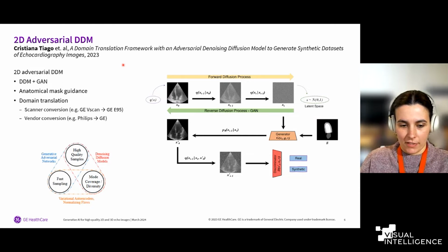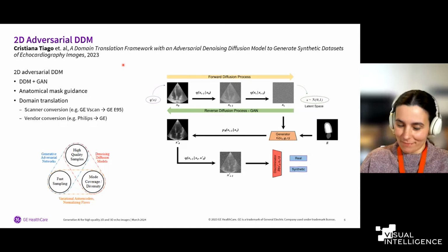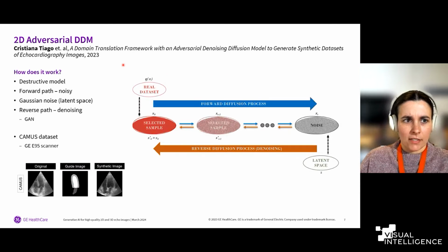And then instead of training another segmentation model, I performed some domain translation operations. So we could see that this model, we could prove its generalization power, so to say. It can generate the equivalent of any image in another imaging domain.